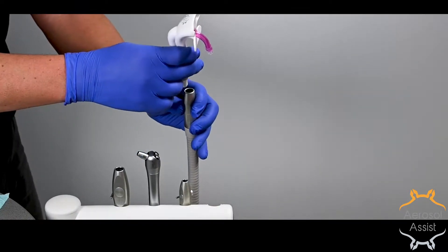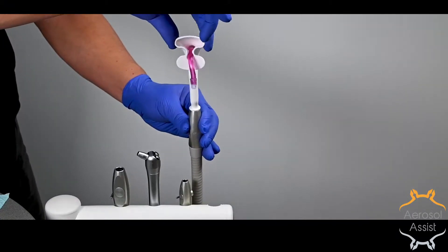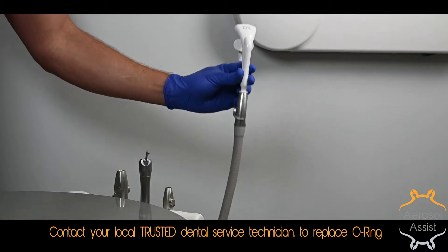After installing the saliva ejector into the aerosol assist, verify the O-ring inside the HVE is intact, then install. This will allow easier rotation to minimize torque. If it's loose, your O-ring may be worn out or missing.